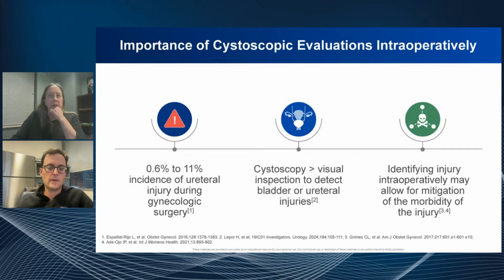So Ben, we'll start with, at the beginning I mentioned that we use cystoscopy in many of our gynecologic and urogynecologic surgeries to assess ureteral patency. Can you just start by telling us why this is important?